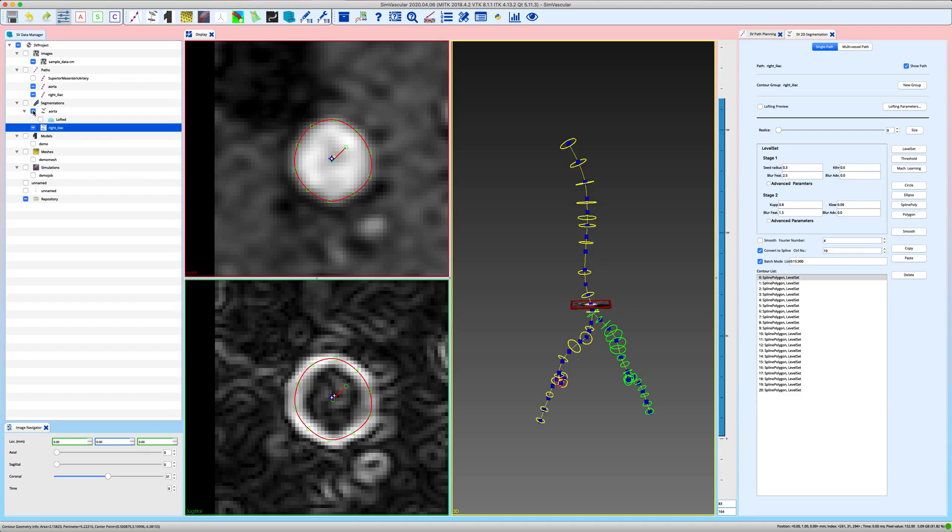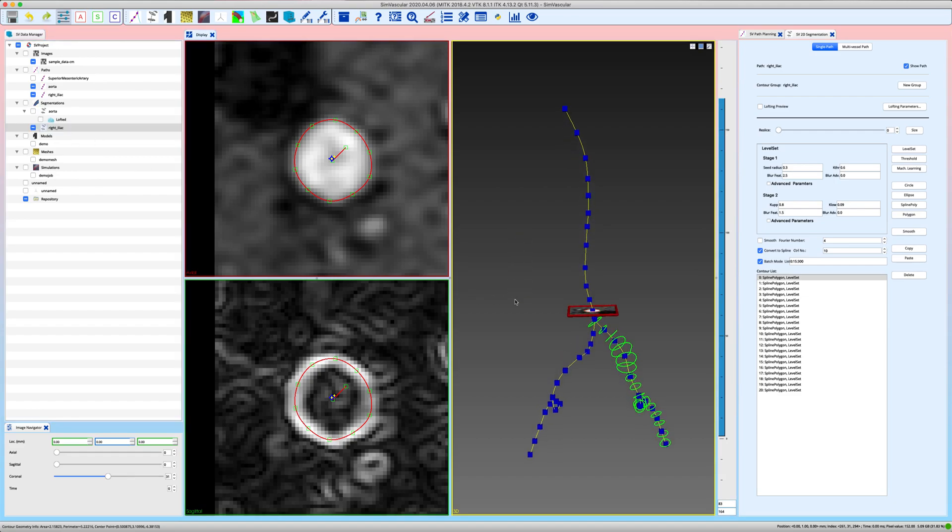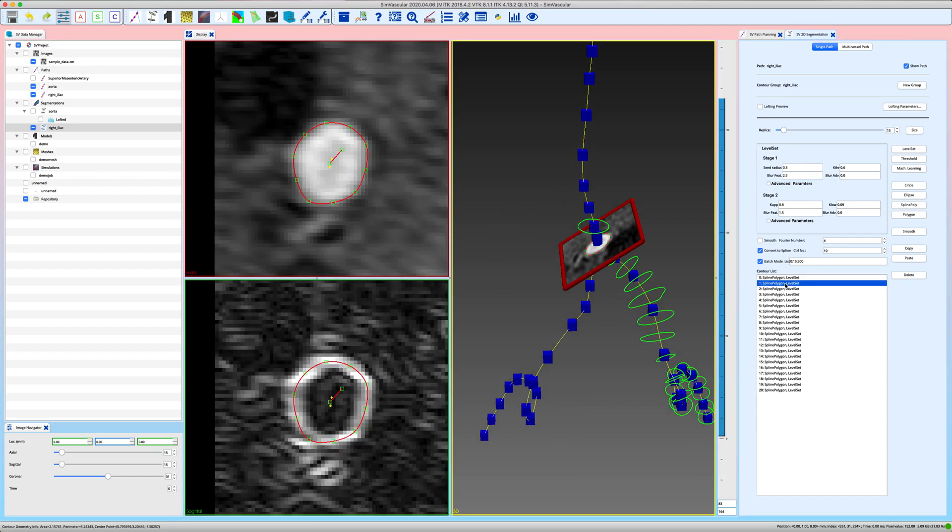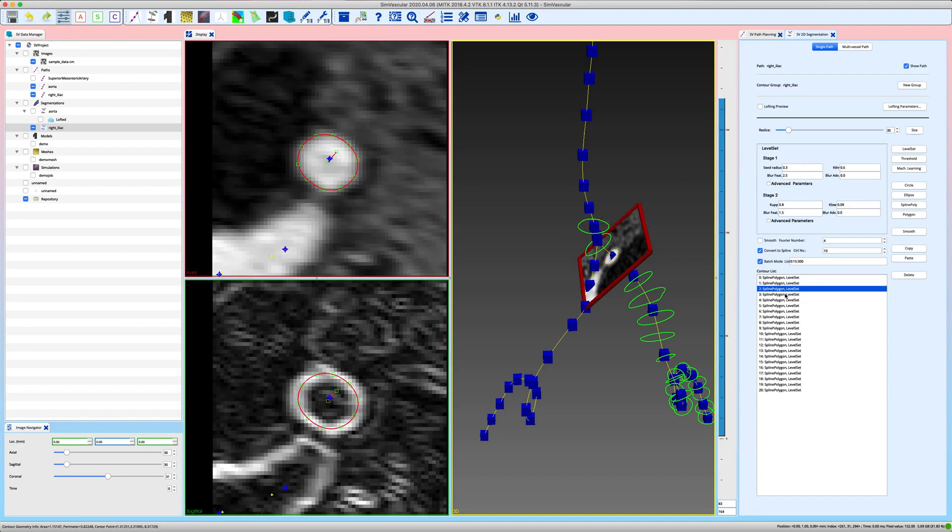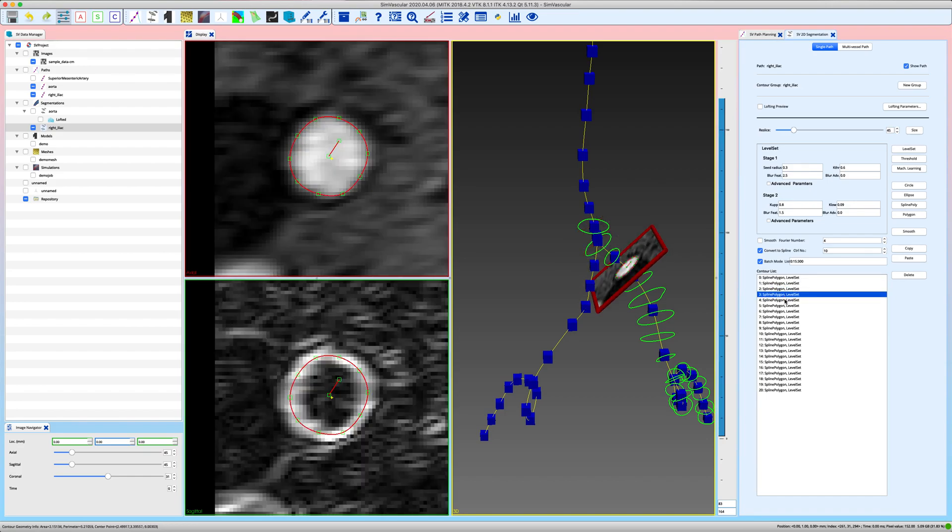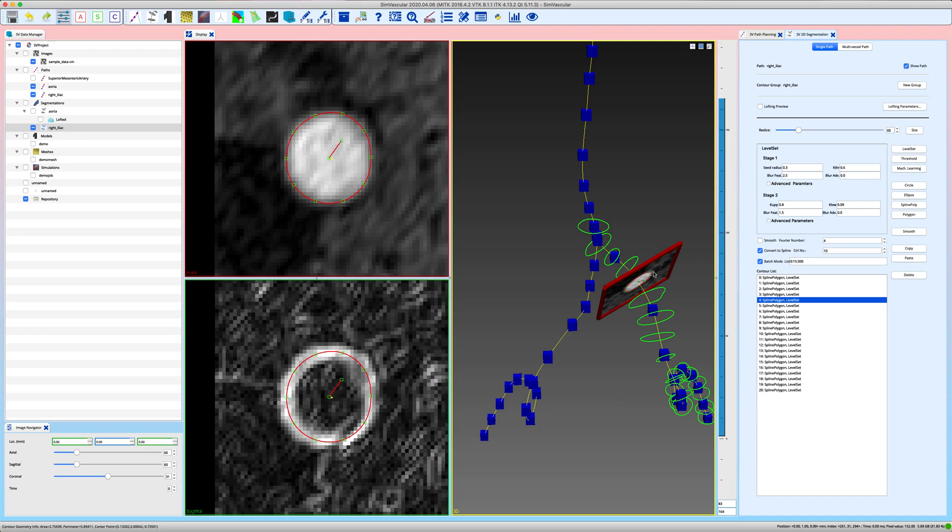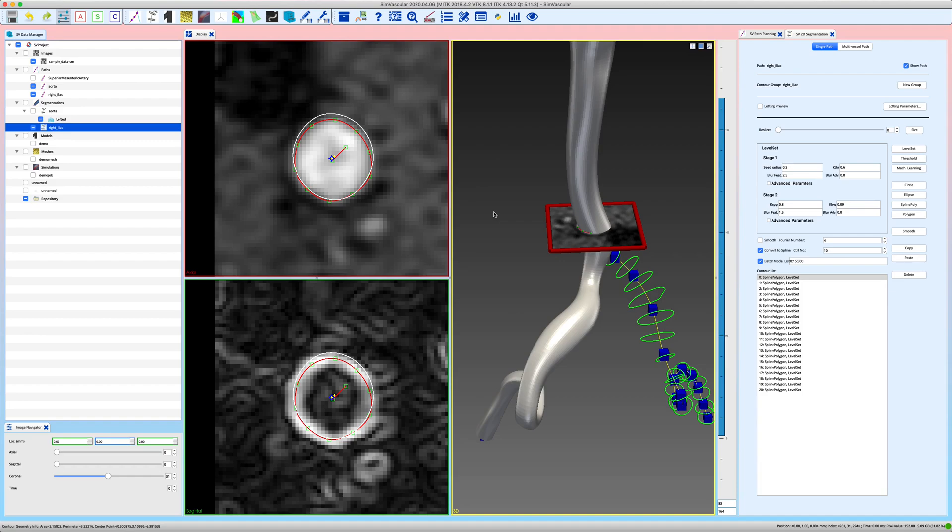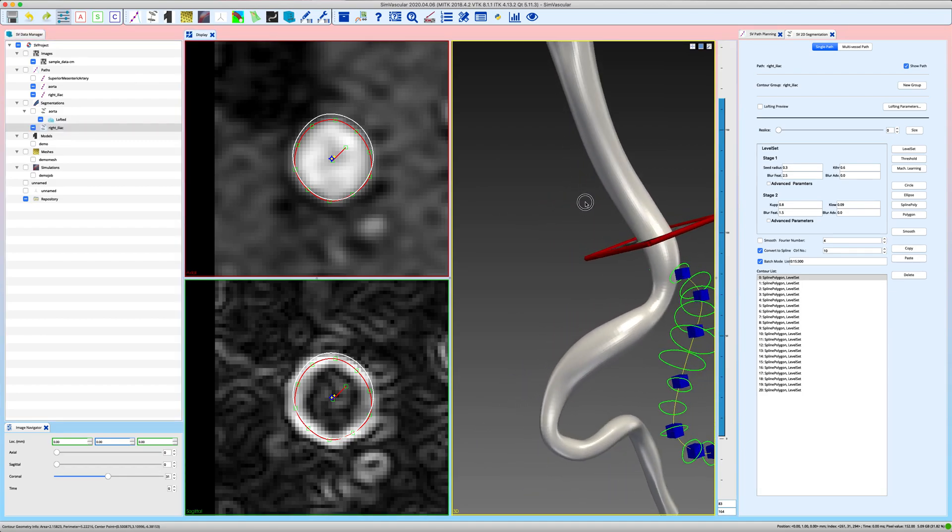Okay, all our segmentations are created and let's go through them one by one. I will hide the lofted aorta model just for now so that I can better see how my right iliac segmentations are doing. Okay, this is the first one, it's well aligned with the aorta second segmentations. And now I'm just going to look at the upper part and the lower part you would have to double check just as you did with the other segmentations for the aorta. Okay so let's just look at those upper four segmentations.